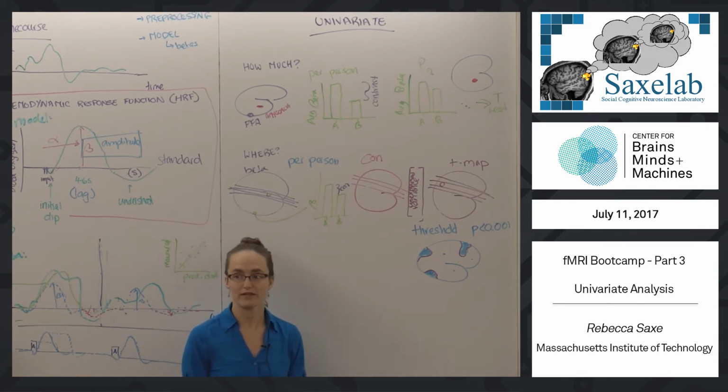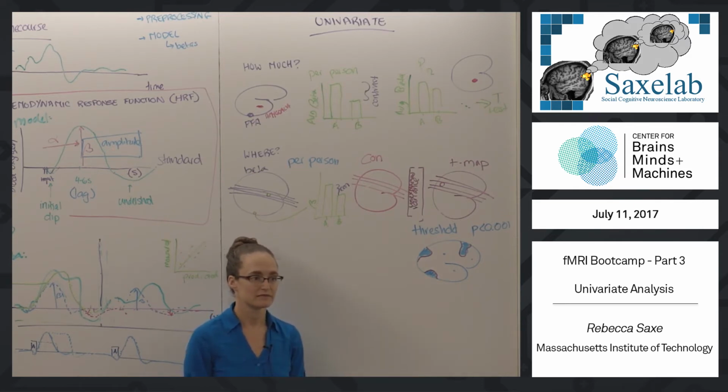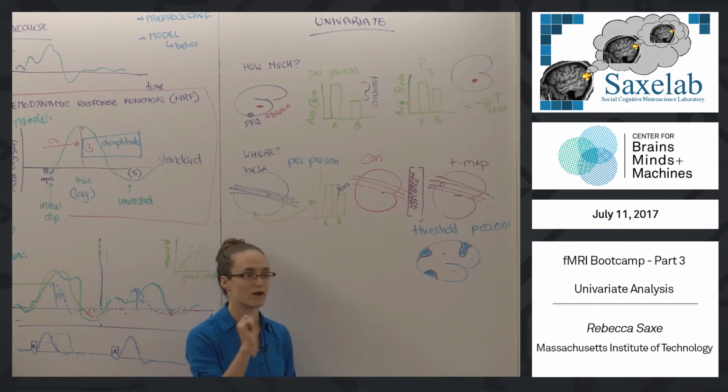In the baby paper, we did the same thing. One baby, their brain, and colored blobs on it. If that's what you're publishing, you got them this way. That is relatively unusual now in adult standard fMRI analysis, that you publish each individual person's brain. But in weird populations like babies or people with brain damage, that's what you might publish: each individual person's brain and a statistical map on their brain of where the differences were.